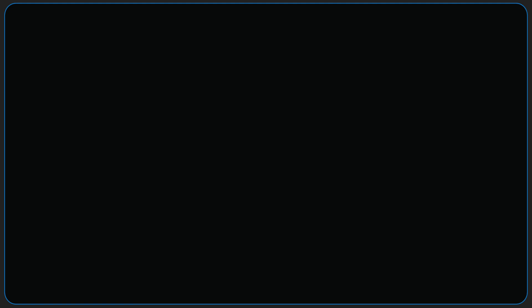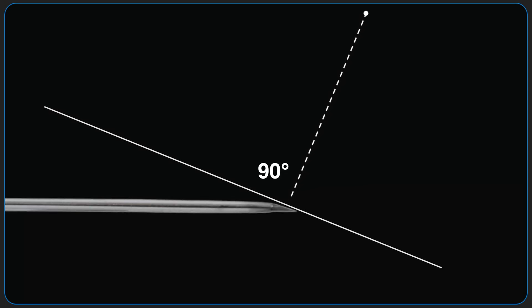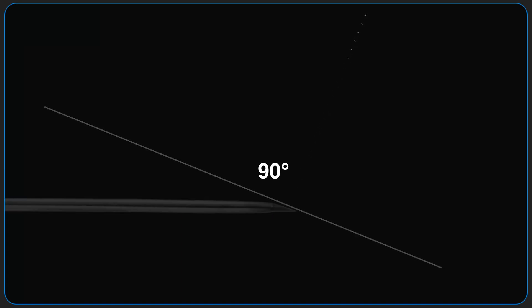As the needle tip is located right next to the bevel, clear visualization of the bevel allows definitive and dynamic location of the needle tip in tissue. In order for the bevel of the needle to act as a specular reflector, it needs to be placed perpendicular to the direction of the ultrasound beams coming from the transducer.